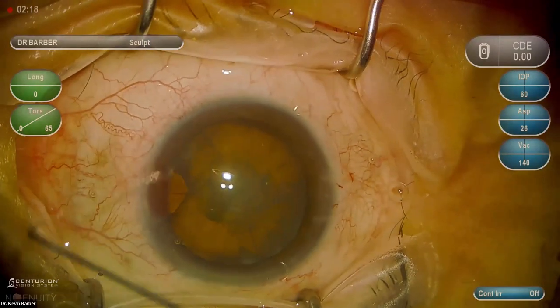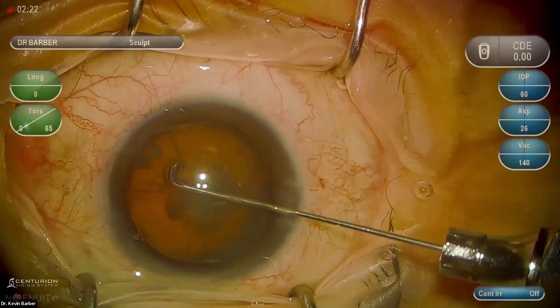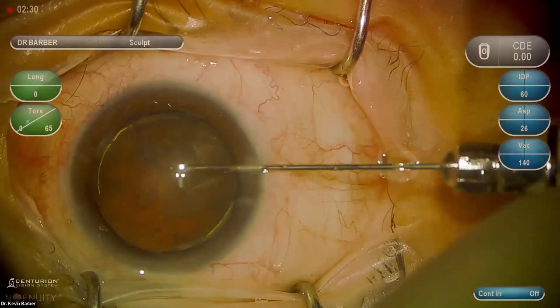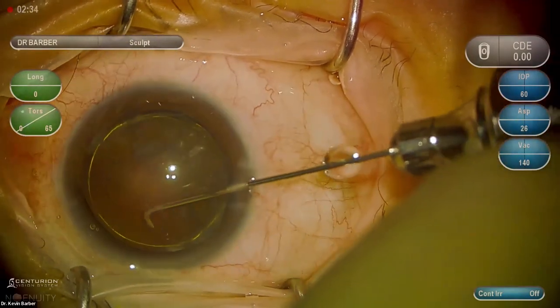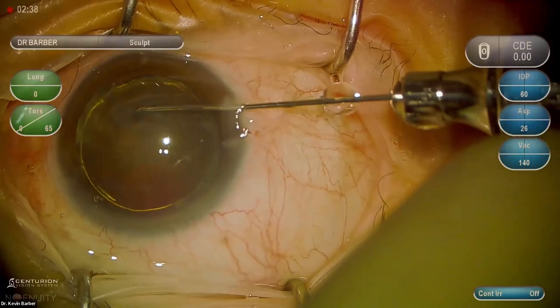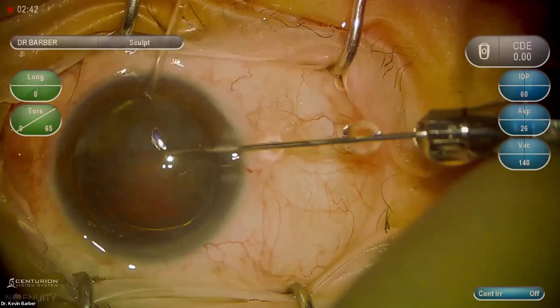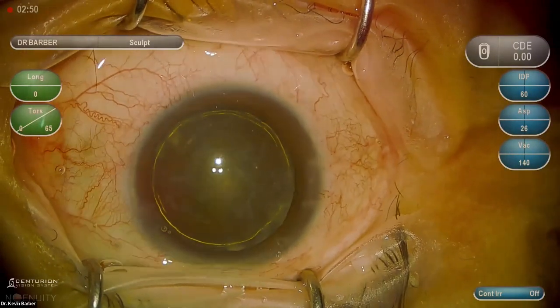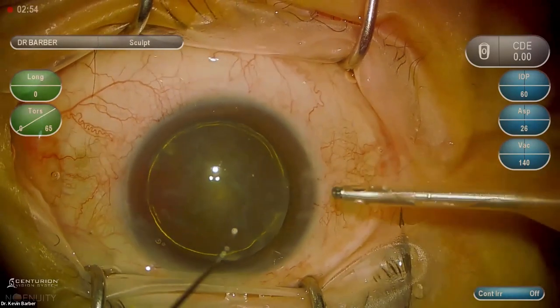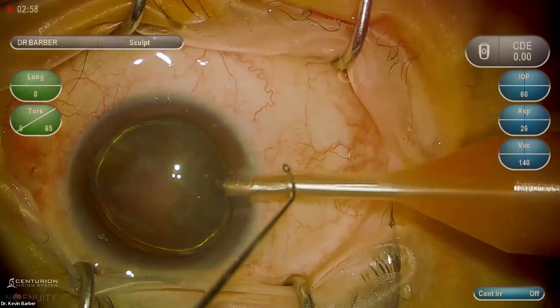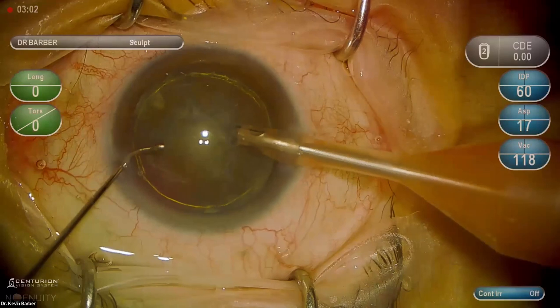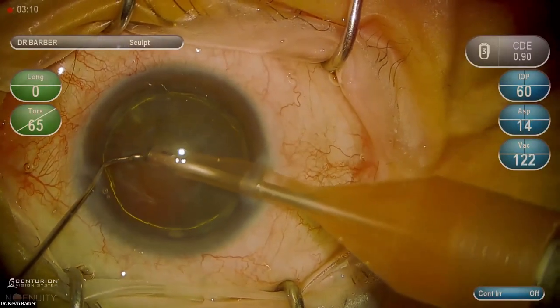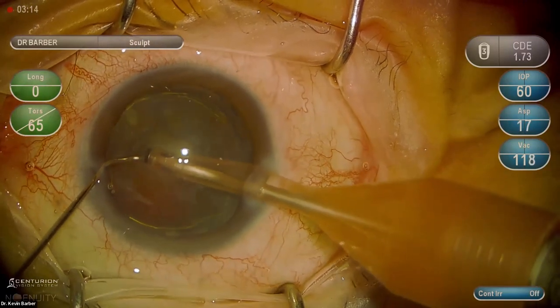That was a beautiful capsulotomy — one of the critical steps for both toric and ATIOL surgeries. If it's de-centered, does that change the decision on implanting an ATIOL? If it's mildly de-centered, no. But if you have an anterior capsular tear, yes — that will likely affect your ELP and IOL centration, so think twice about implanting in that case. If you have complications or difficulties, go to plan B and don't implant an ATIOL.